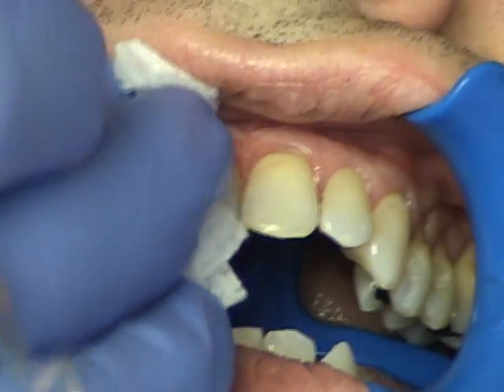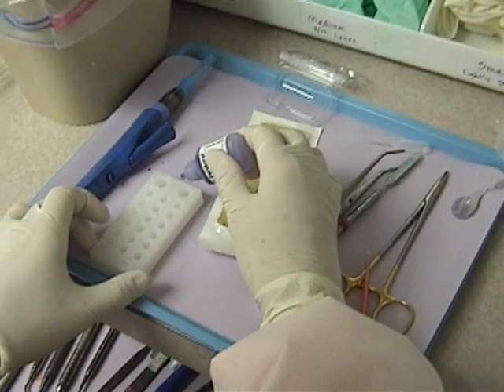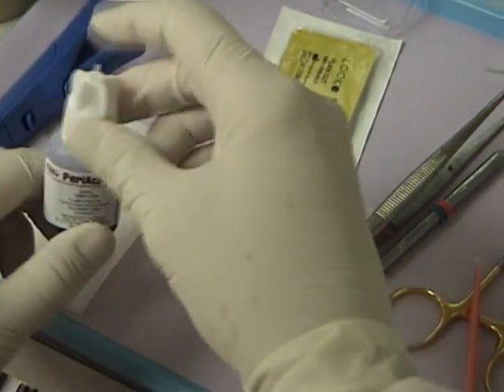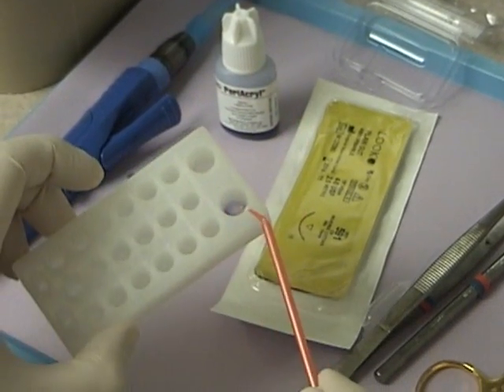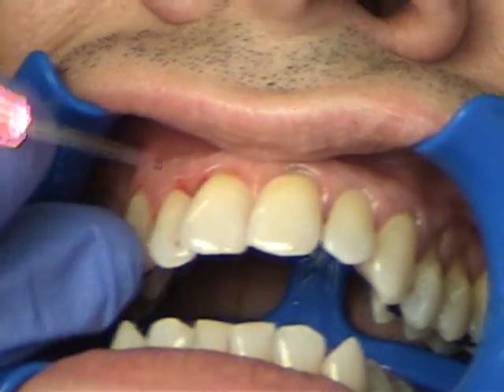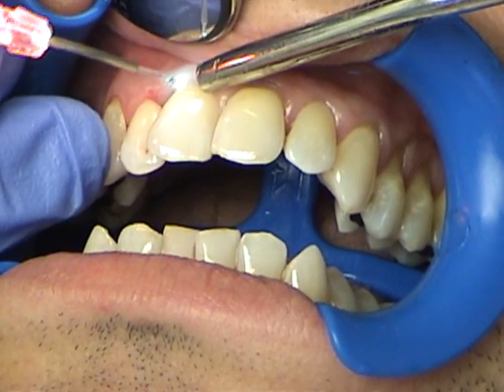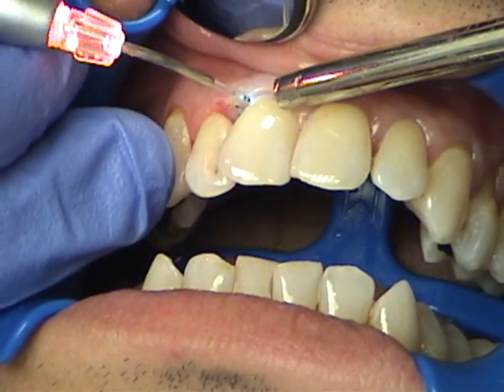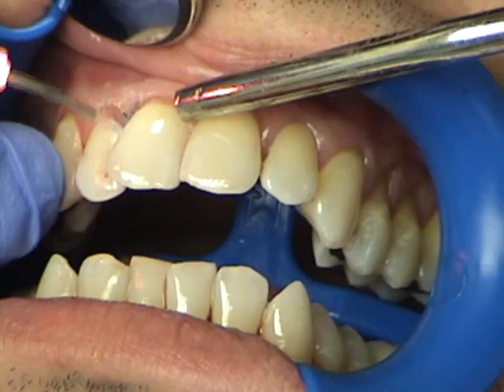We put a little compression on the area for about a minute or two. This is Pericryl — a glue stitch. We put a few drops into the well and apply it with a mini sponge. Then we step it into the other dish. We have one more step: de-epithelialization. This is just a little de-epithelialization about three to five millimeters away from the focus — this will delay the epithelial downgrowth. Just a little cauterization to remove any little tissue tags.